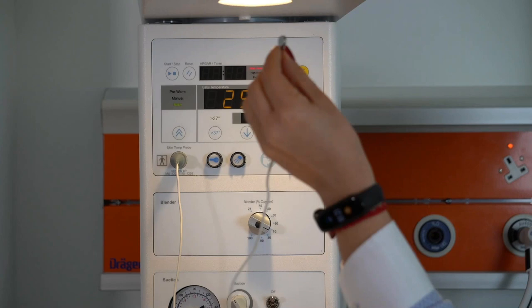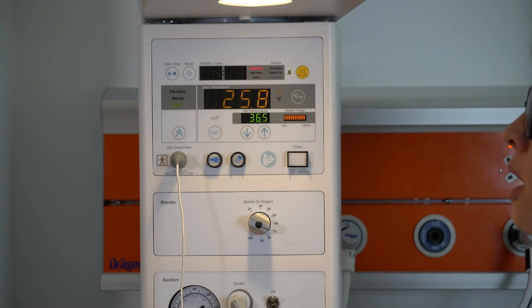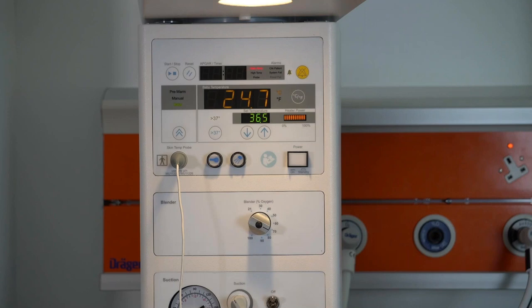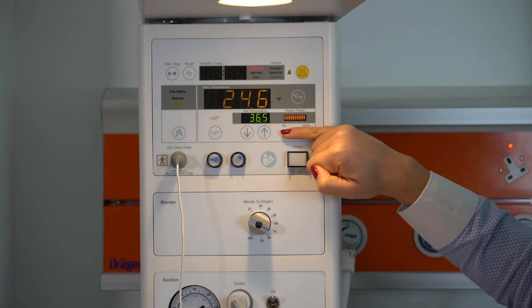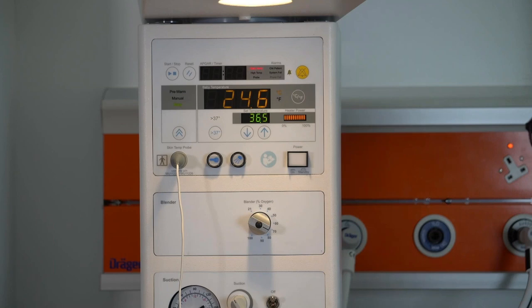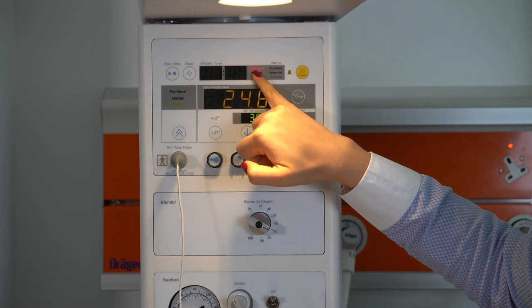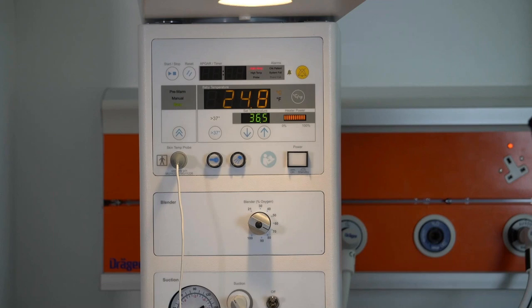Now, obviously, we see that the temperature is extremely low. I'll try to warm it up a little. First of all, we see that our target temperature is 36.5. Currently, we are at 24.8, which is very, very small. And we see that the heater power is at 100%. So now the device is trying to work really hard to reach the set temperature of the baby. What we also see is that we have an alarm, and I currently disabled it for 2 minutes, but we also have an alarm that the baby temperature is low. So you will always know that the baby's temperature is not reached because the device is giving you an alarm.